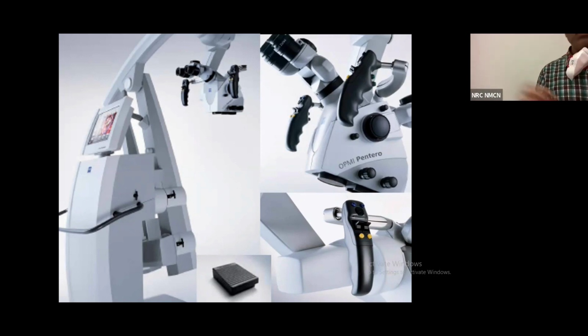Apart from that, it is a customizable thing. You can change the settings. You can start the recording in the microscope, you can stop the recording, you can take a screenshot, you can transmit it to the TV screen, whatever you want to do, you can customize these settings. You can shift the microscope a little bit. I'm not sure whether you are able to see or not, but there's a small joystick out here. It has 4 directions: up, down, right, left. So you can move the microscope to some extent by using this joystick as well.